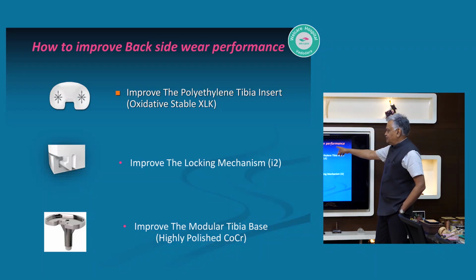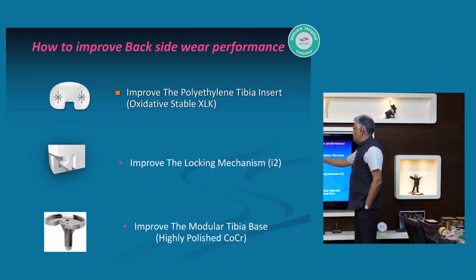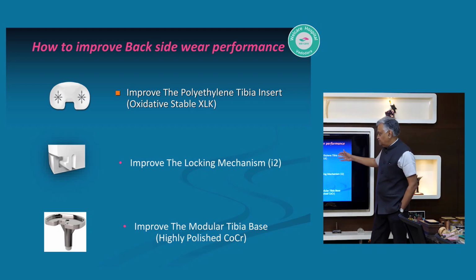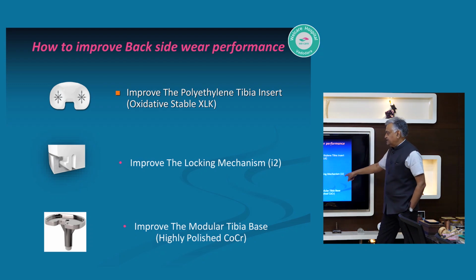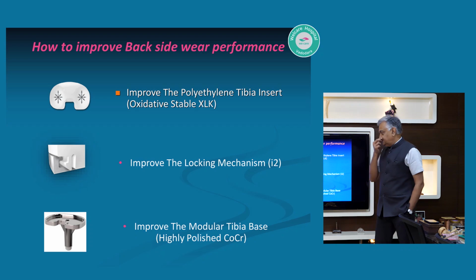Next. How to improve backside wear? Just quickly, I already mentioned all this. Improve the quality of the tibial plastic characteristic. We'll talk about it as a separate lecture: how to improve, what the ways and options are. Improve the locking mechanism, the way in which a plastic insert locks onto the tibial plate.